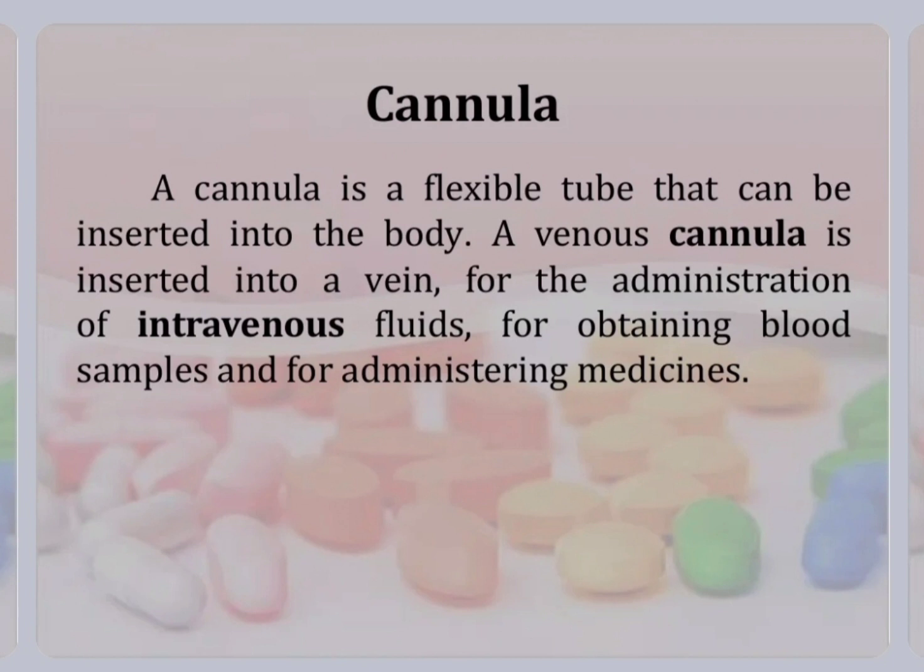When it comes to the peripheral venous line, we can call it a peripheral venous catheter, peripheral venous access catheter, peripheral intravenous catheter, PIVC, or simply PVC, that is peripheral venous catheter, and the procedure is catheterization. So simply it is a catheter or IV cannulation, but in the superficial or peripheral lines of the patient's body.